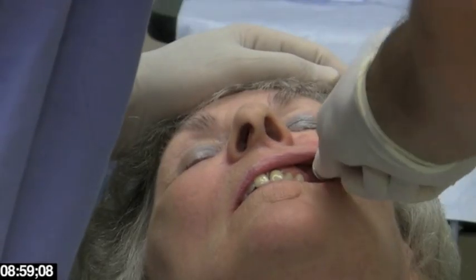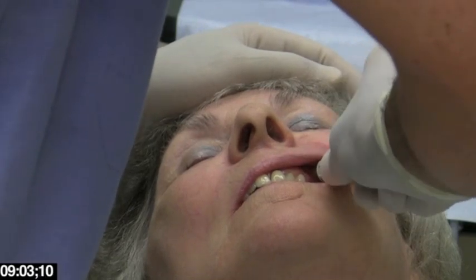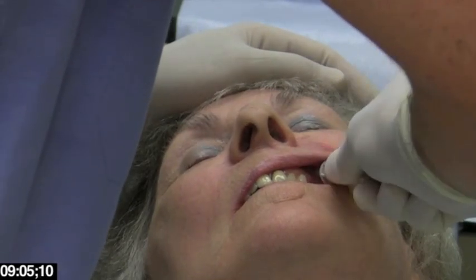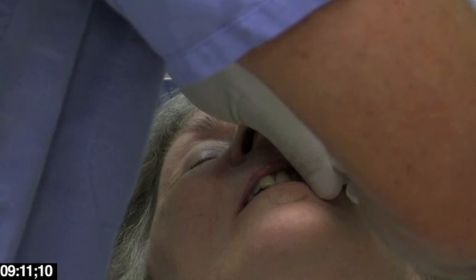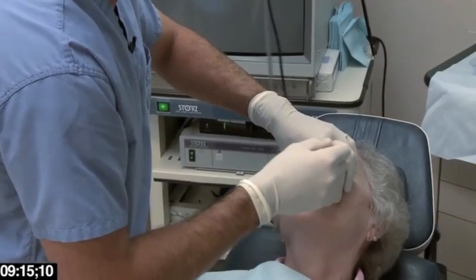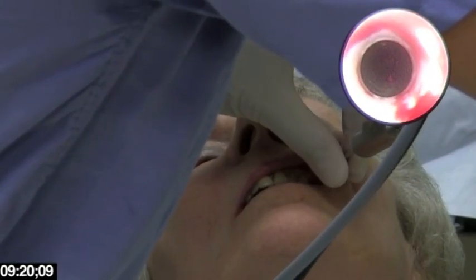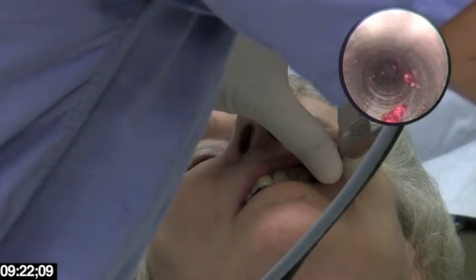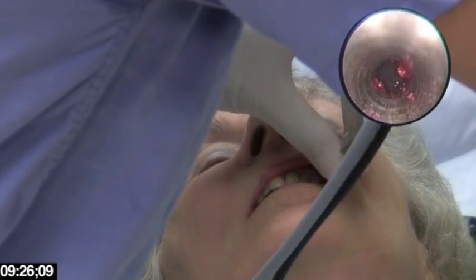It's a very gentle, smooth motion. The angle I'm bringing it down to is oriented just towards the sinus. I keep the sheath in place and withdraw the trocar. Now through this sheath I'm going to pass the endoscope. We're going through the sheath, watching this on the video now, and we're entering into the sinus cavity itself.